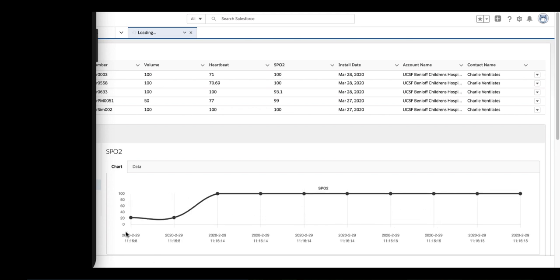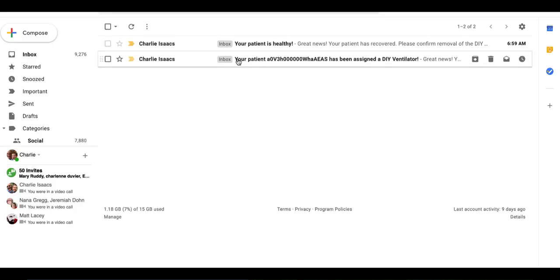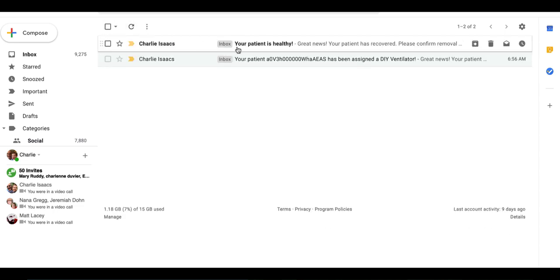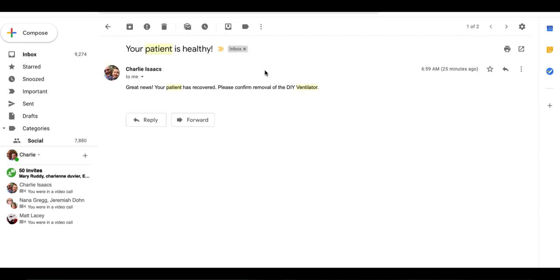Here are the email notifications that go out to the doctor. When the patient is assigned a ventilator, the doctor gets notified. And also when the patient recovers, they're notified and they can authorize removal of the patient from the ventilator.